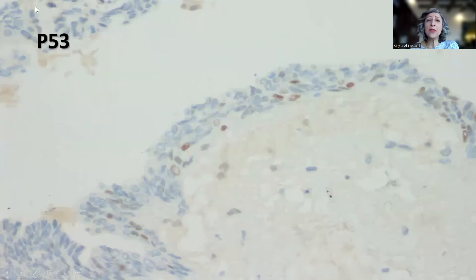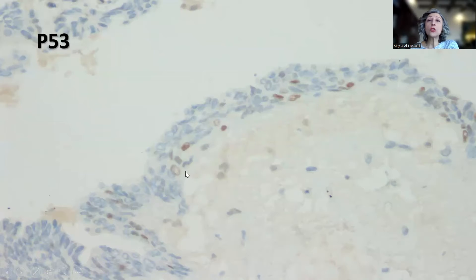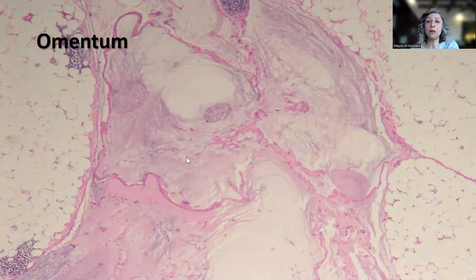And then the P53, unlike the high-grade mucinous neoplasm, shows a mosaic staining pattern, so this is non-mutant.